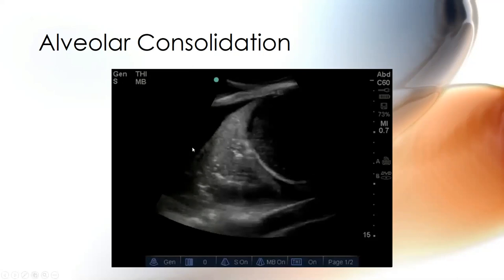So Juliana said there's fluid. So let's talk about echogenicity again. We now know that this is lung, and it's very clearly highlighted. But now we've got this black. Black. There's even some black over here. And what did we say black was? Black, anechoic, no echoes. And there's no rib here, so there's no giant rib or something that is casting a shadow. If there was something here casting a shadow, you shouldn't see anything here at all. All of this should be black. But what I've got is black, black, black. All of this is anechoic. Anechoic very often is fluid of some kind. It could be fluid, like a pleural effusion. It could be blood. You can't tell based on this image if it's blood or a pleural effusion, or it could be a hemothorax, any of those things.